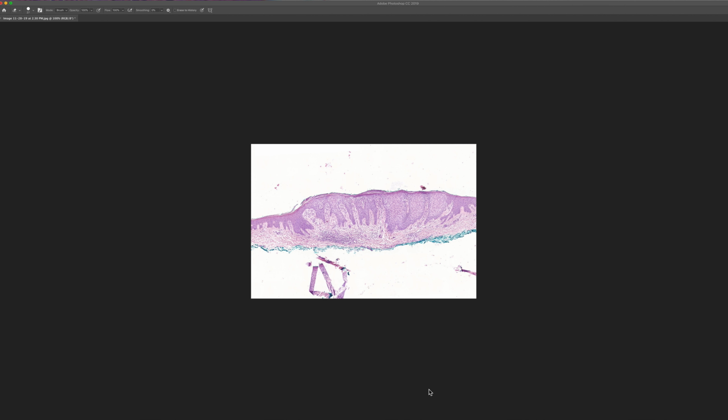In this video, I want to show you how to add contrast and color to a rather pale photograph. This is a nice case of clear cell acanthoma which Antonina Kalmykova from CSD Health Care in Kiev shared with me, and it's a perfect example of a spot diagnosis.